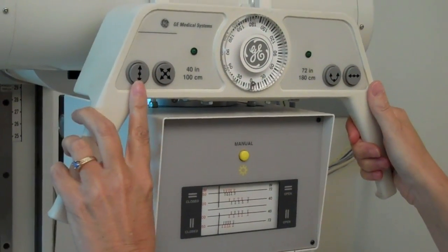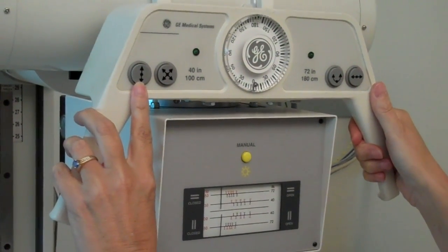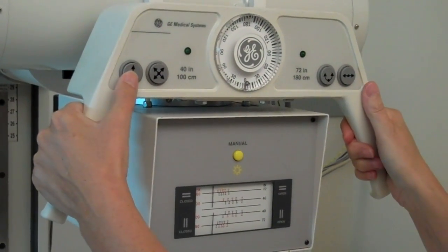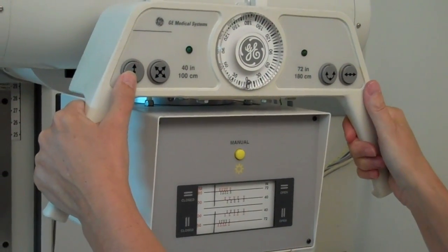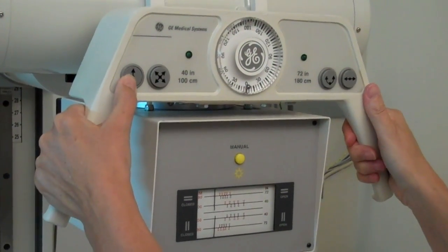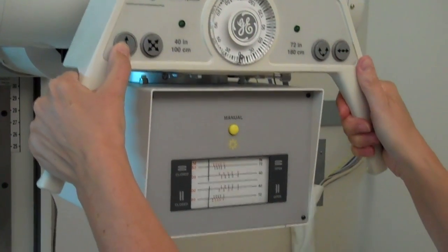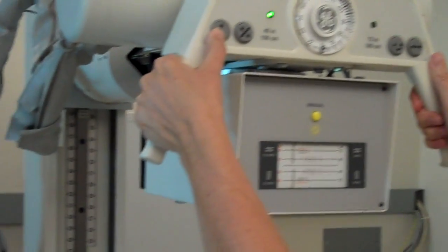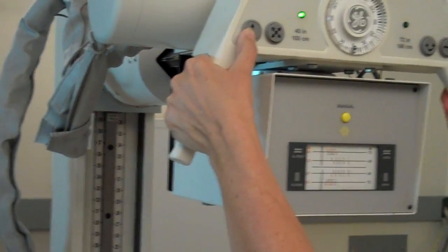Vertical movement is this button. You must depress it. It's an electronic lock. It adjusts the source to image receptor distance, which is known as the SID.